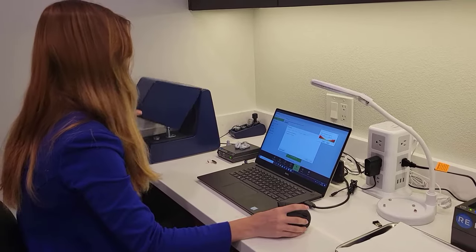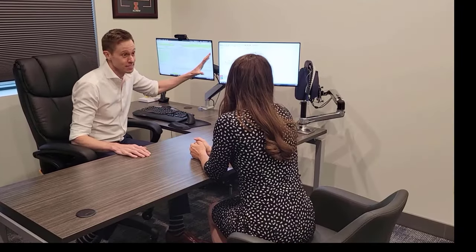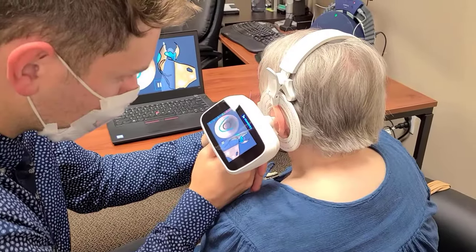Regularly cleaning your hearing aids is one of the most important things that you can do as a hearing aid user. Cleaning your hearing aid not only helps maintain optimal performance, but it can also extend the overall life of your hearing aid, meaning that you can use your hearing aids for several years without needing replacement.